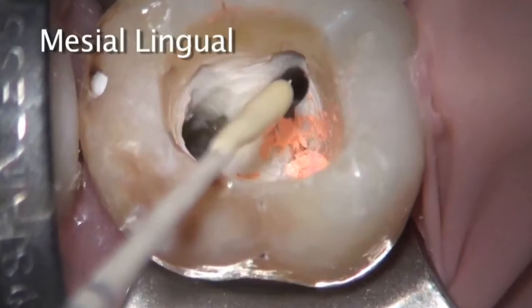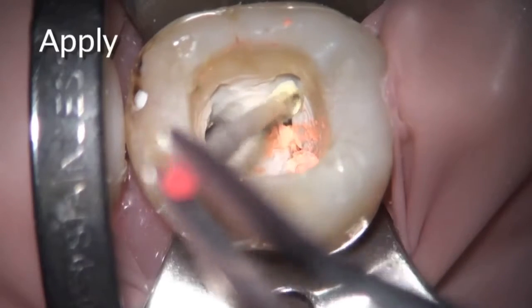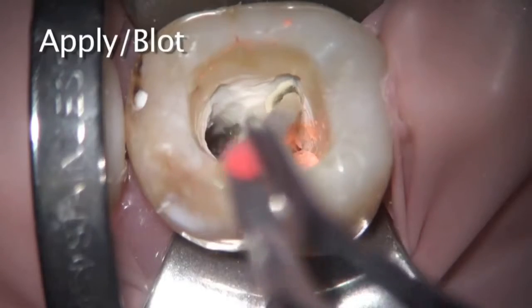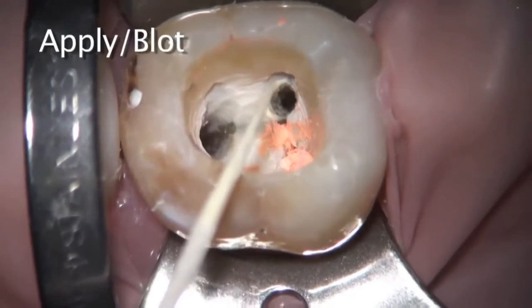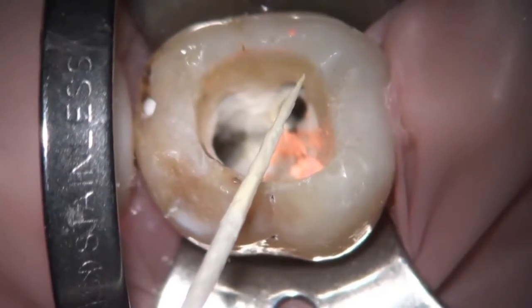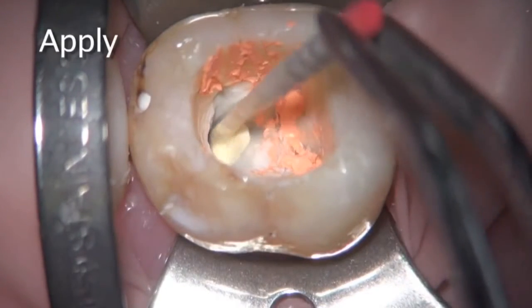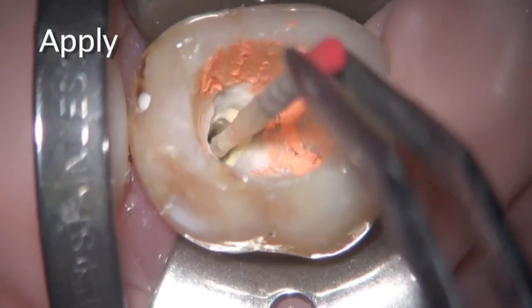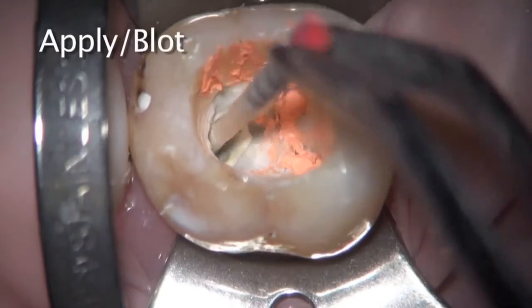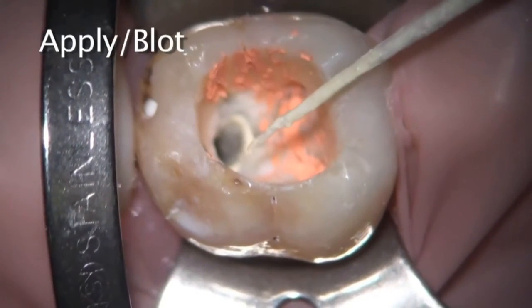Same thing then in the mesial lingual canal — and I would go just a little bit more there, taking out just a wee bit more than what the video shows. And now the same thing in the distal. You can see the effort made to coat the entire canal surface, even though that's quite a bit. Now pulling more out, and I would blot off that extra at the orifice level.